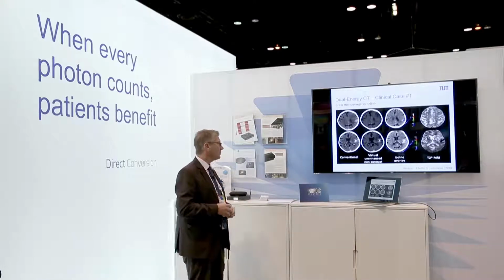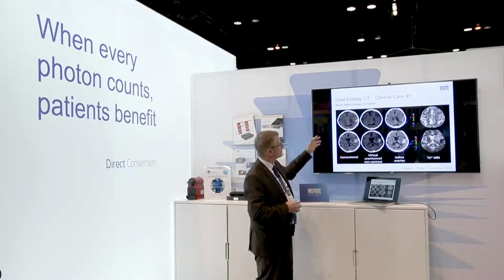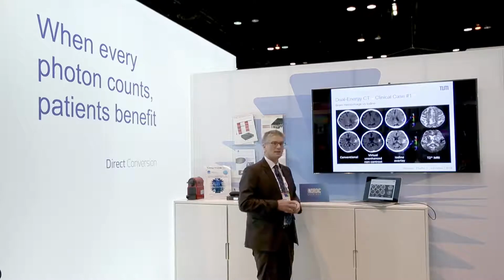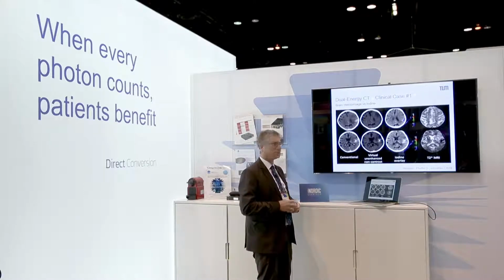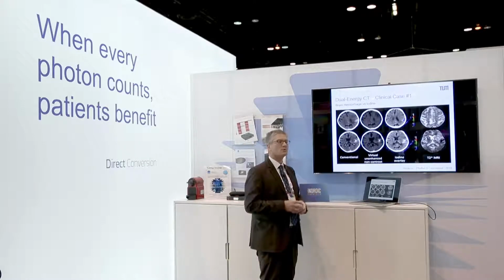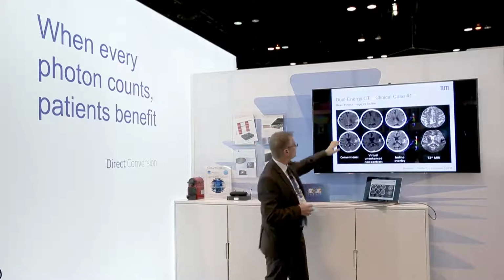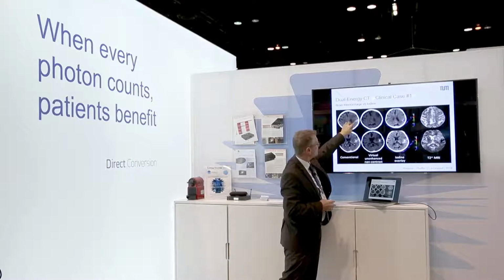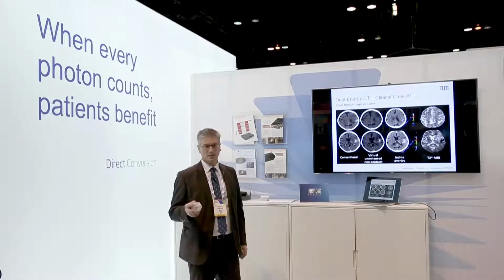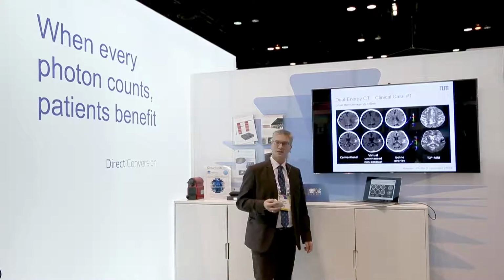These are 2 patients after an interventional thrombectomy. This is an interventional procedure in the brain. And typically after 10 or 12 hours, you do a control scan because you want to know if there are some hyperdense areas left, which would show if the operation has been successful or not, so if you still have bleeding or not. You see in these 2 patients that there's a hyperdense area here and here. So the big question now is, is that new blood, hemorrhage, or is it a remainder of the interventional procedure where iodine has been used?